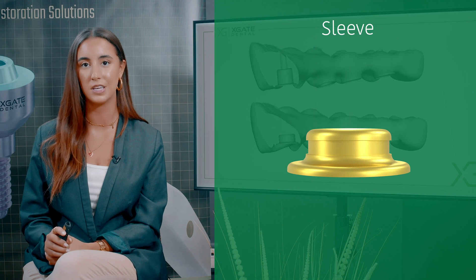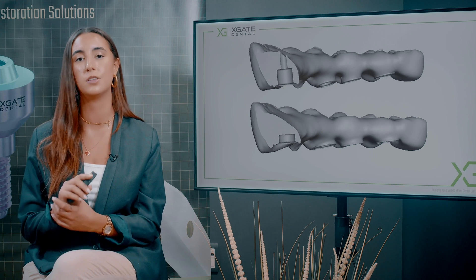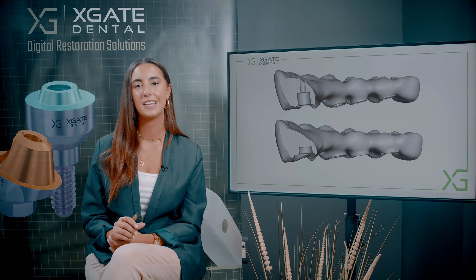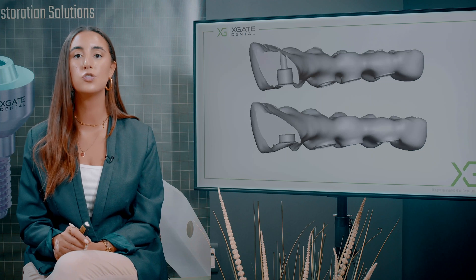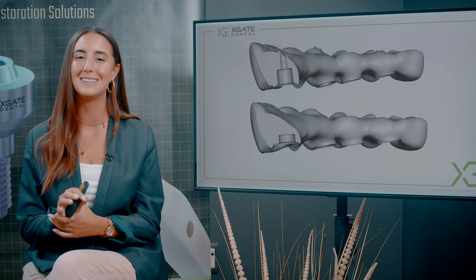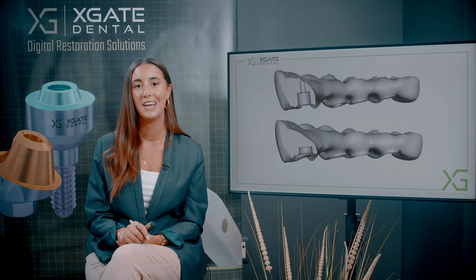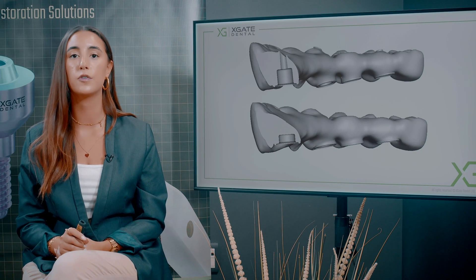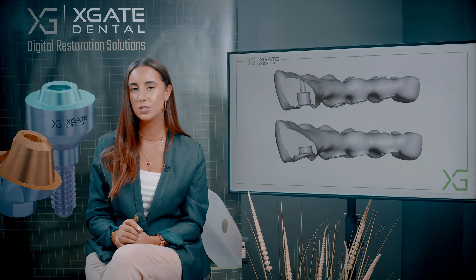It doesn't hold on the sleeve — it just sits on the multi-unit. The vertical forces all go straight to the multi-unit and the bridge will be stable. You have enough material to hold it, and because we eliminated the screw channel and made a smaller sleeve, we managed to remove all of the material from the upper part of the bridge. This part of the bridge is not in a deep bite, so the patient doesn't close right on the bridge. It has much less force on top, and the vertical forces go right to the multi-unit, right on the implant.